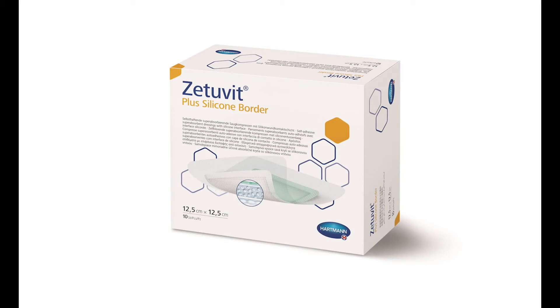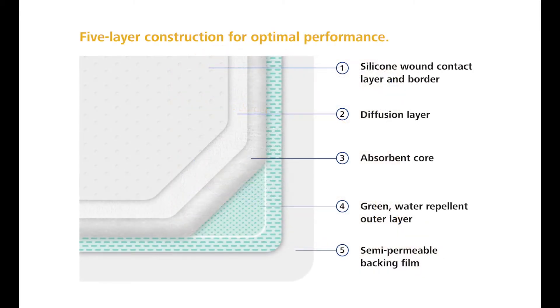The key benefit of the Zetivit Plus silicone border dressing is that it offers a very high absorption and retention capacity while maintaining an optimal microclimate.